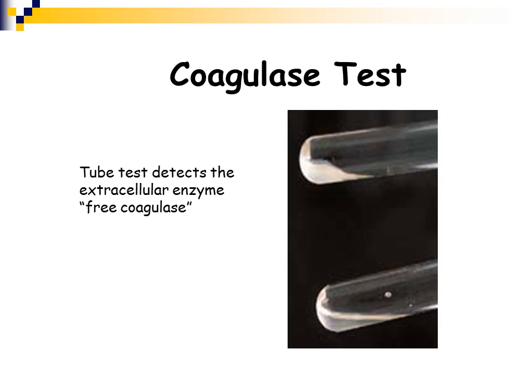The tube test used to be the standard coagulase test done in the clinical lab. Now the tube tests are not done anymore because you used to have to incubate the tube overnight, so you really wouldn't know if you had a Staph aureus for at least 24 hours. So with the commercial-based tests now, you can do a coagulase test in, like I said, just a minute or two.